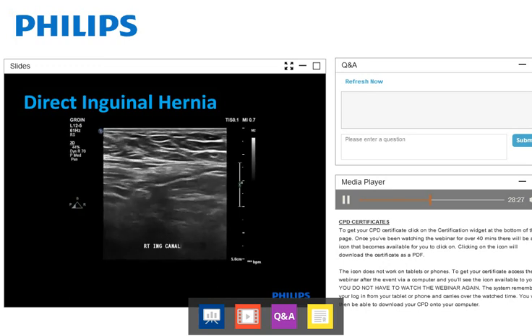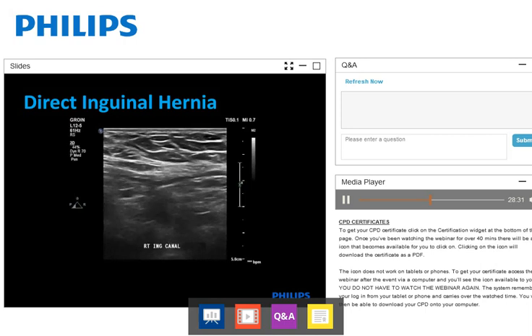These video clips are a little bit slow over the internet tonight, so I do apologise for that. But we can see here, instead of going in the normal opening, this is coming up through a defect in that posterior wall. So you can see the fat coming up through the middle of the image, turning right and making a 90-degree bend going down the canal.